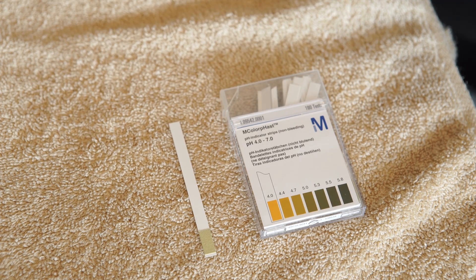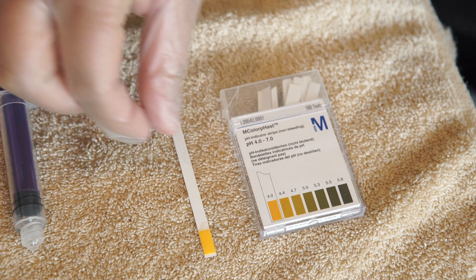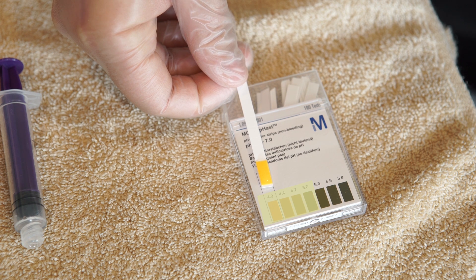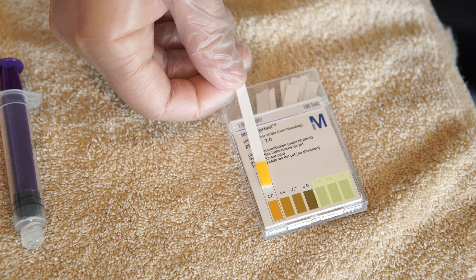Gently push the syringe plunger to apply a drop of stomach contents onto the pH strip. Immediately compare the color of the pH strip to the color chart provided with the strips. The pH should be 5 or lower. If the pH is higher than 5, follow the plan of care for replacing the tube.